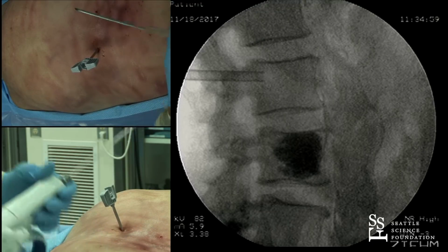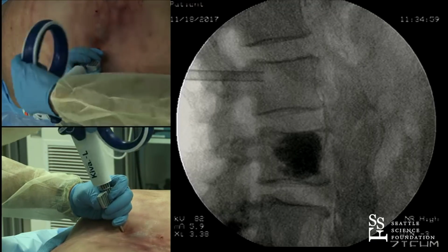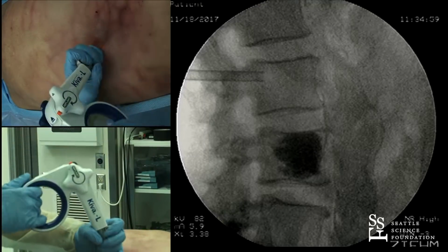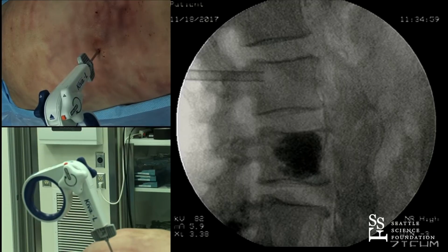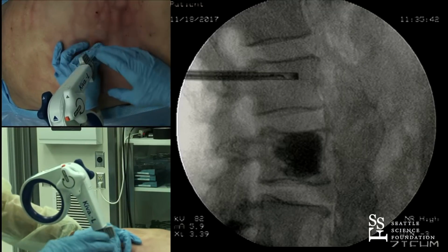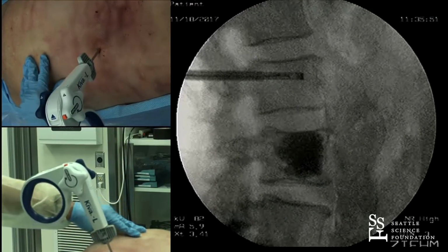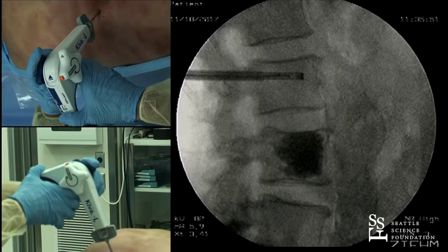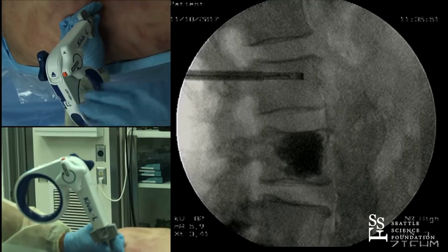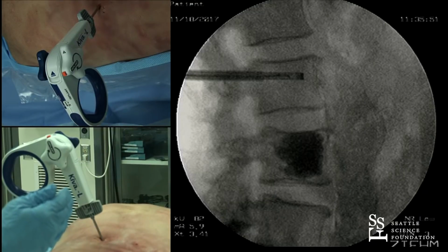So we'll have to deploy the implant over the coil, the nitinol nickel titanium coil. So we'll put this down in, and this directionally goes to the opposite side. So we have a nice placement here, and this mimics the position that the inner stylet was, so about 5 millimeters from the anterior portion. Before you deploy, Doug, can you get an AP so that they can understand trajectory? Come back, AP. So we can see from here, we're ipsilateral, and the coil will deploy toward the contralateral portion.